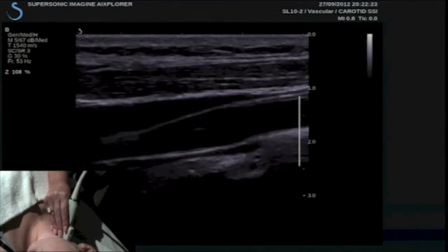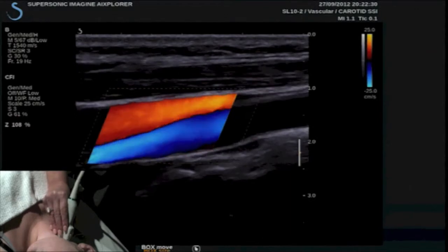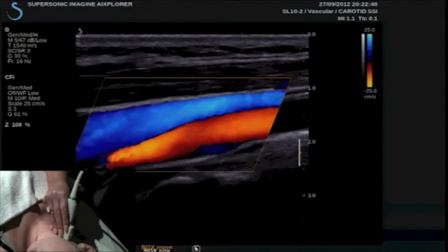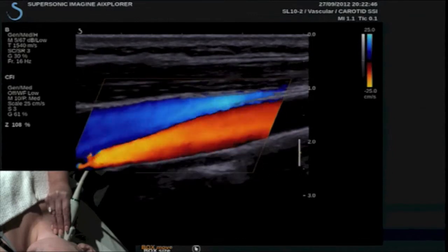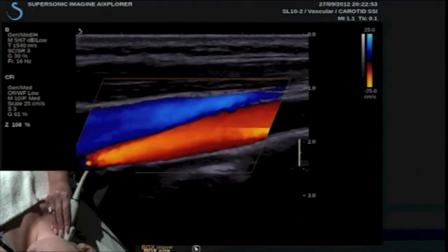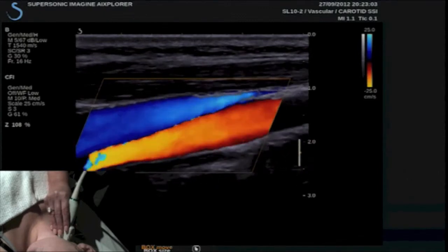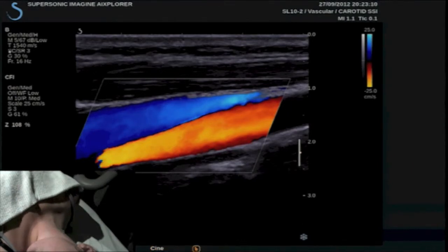Once I have optimized my image, I can go ahead and go into conventional Doppler — color Doppler — and I can change my box size by selecting and using the trackball and touch ring to change the position and size. This is our conventional Doppler, and I just want to observe the excellent spatial and temporal color resolution. The image quality is maintained when color Doppler is turned on. I am going to freeze this conventional color image and point out the frame rate: 16 hertz.